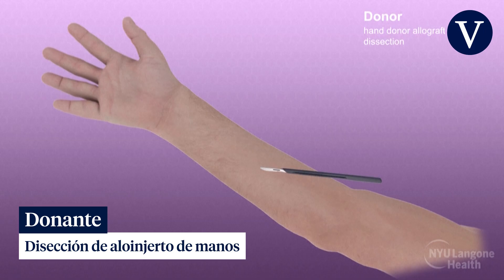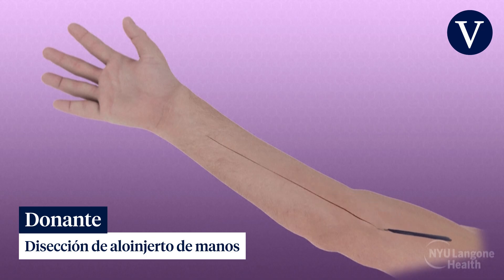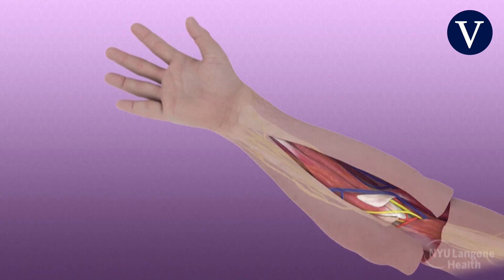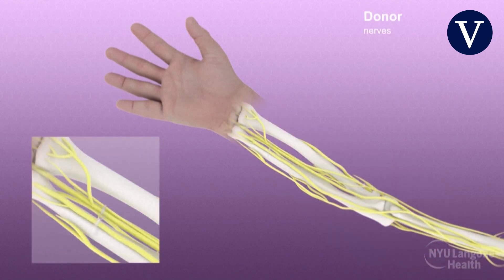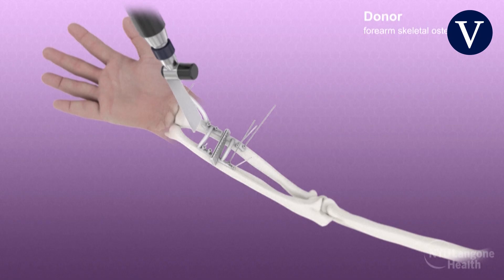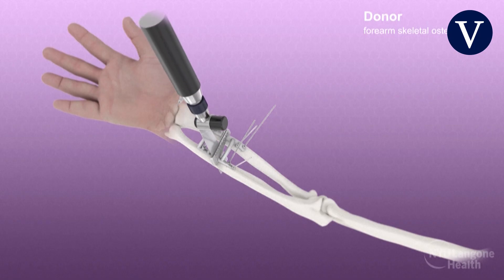Recovery of the donor hands proceeded concurrently with the facial allograft procurement. Soft tissue flaps were raised, taking care to preserve key anatomic structures which were tagged for identification. The radius and ulna were then exposed, and while protecting the neurovascular bundles and soft tissues, prefabricated cutting guides were secured and the radial and ulnar osteotomies were performed.